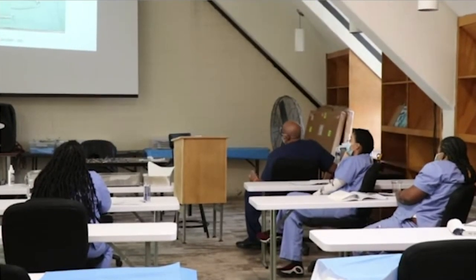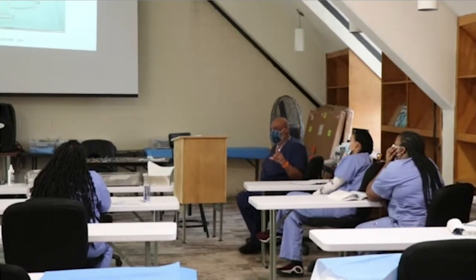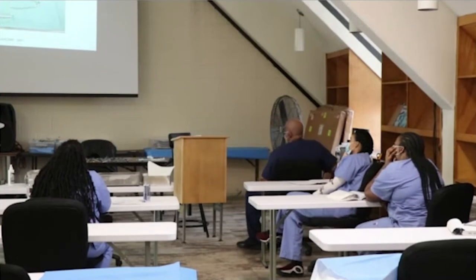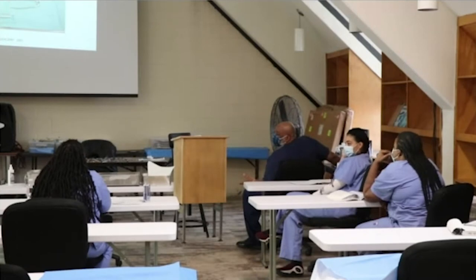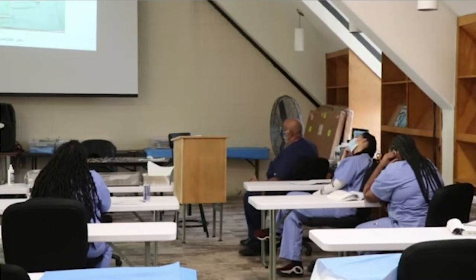These are just some of the different size stringers. Now, that floor tray that's in the back, that tracheotomy tray, I would have used this one, because it's not that many instruments. Remember the one that we opened that the technician did. I won't use the word raggedy, but not as competent, okay? You always want to be proud of your work.